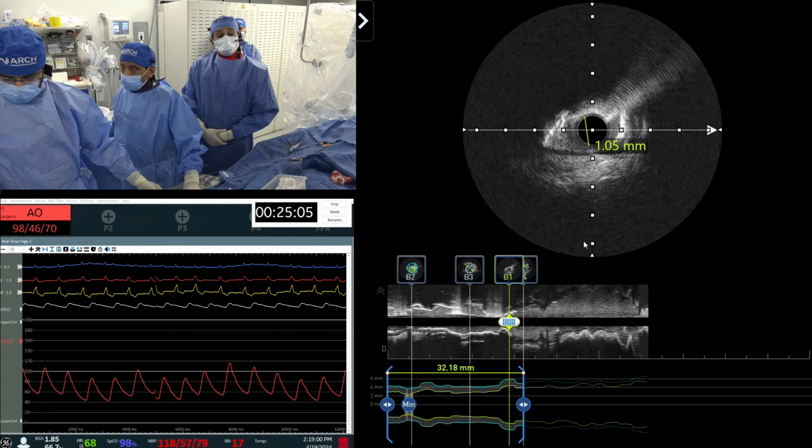Very thick, pull back. The choice of the burr, which is a little bit oversized burr to break into that calcium nodule that you saw, is a very, very reasonable choice. It's a good diagram, all a thought process in pre-imaging, deciding as to what modality to use. There is a looped wire, I think. David? Okay. No, there is a looped wire.